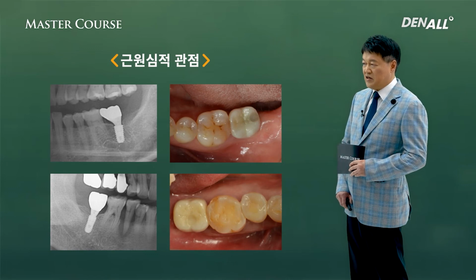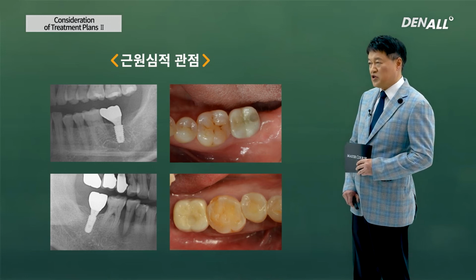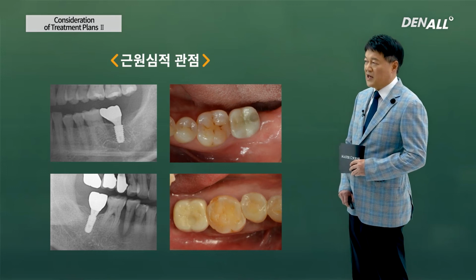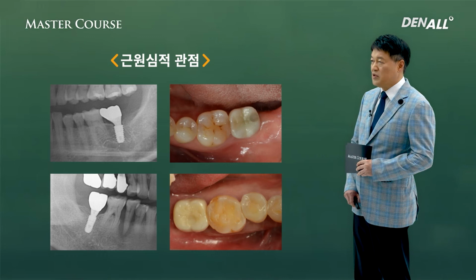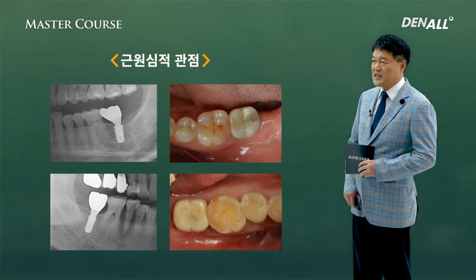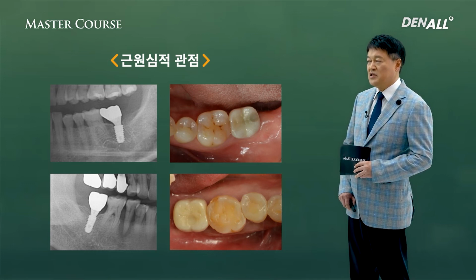in the case below, mesial tilting is done similar to adjacent natural teeth, and the prosthesis hole direction is in the center. However, if the mesial tilting is not done, the hole direction becomes distally inclined and a cantilever effect can occur. So you need mesial tilting similar to natural teeth.